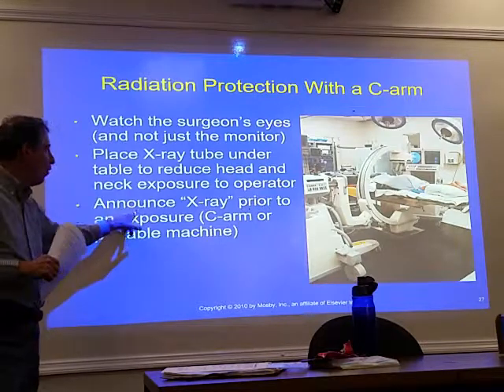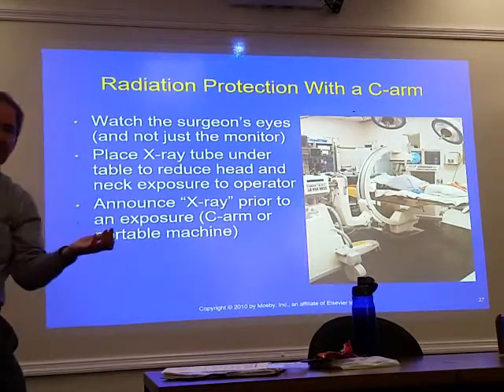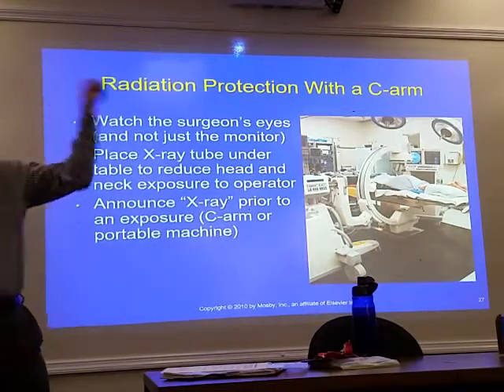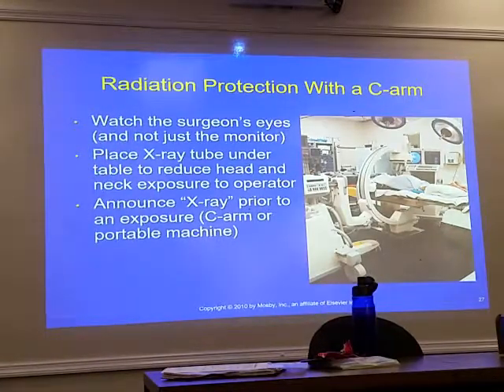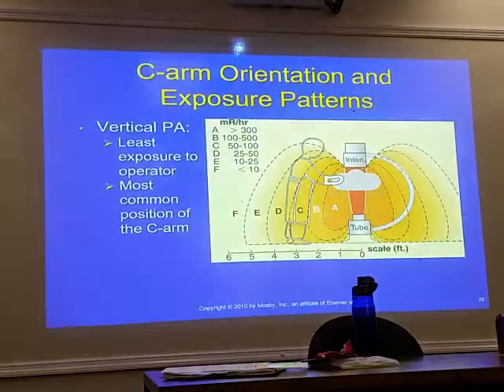And always, whenever I was going to shoot, especially a scout, I'd make sure and just say X-ray, because people aren't really aware of everything. So, you know, just as a preventive thing to do.